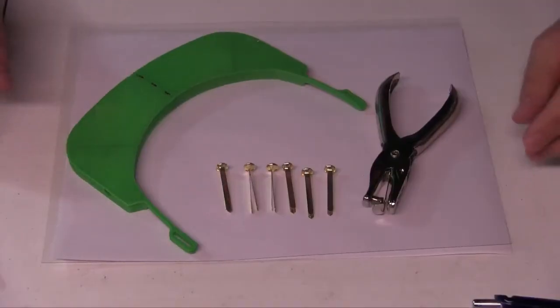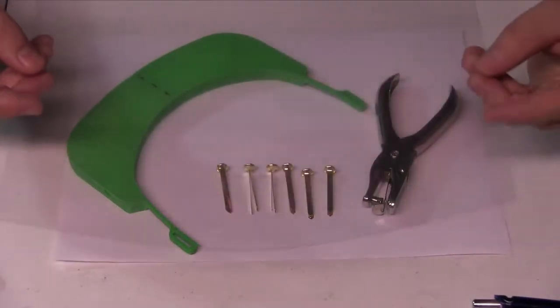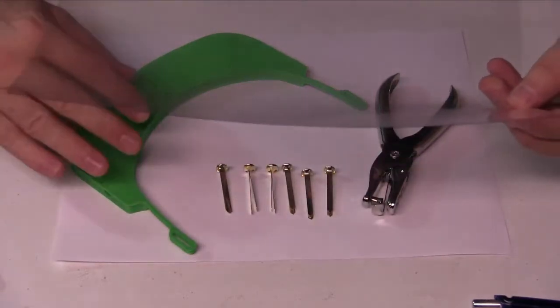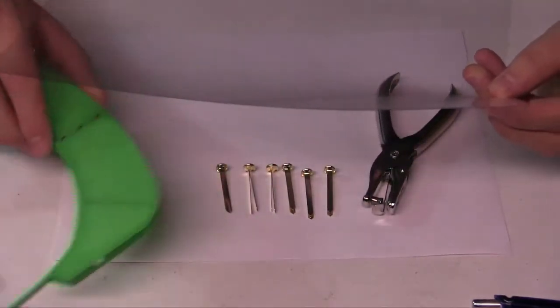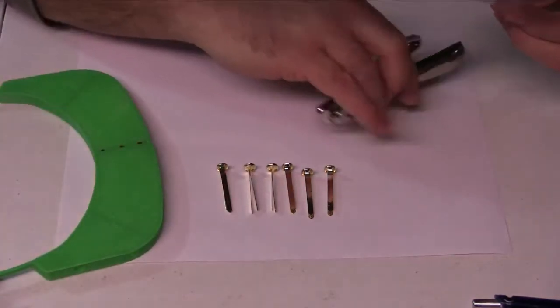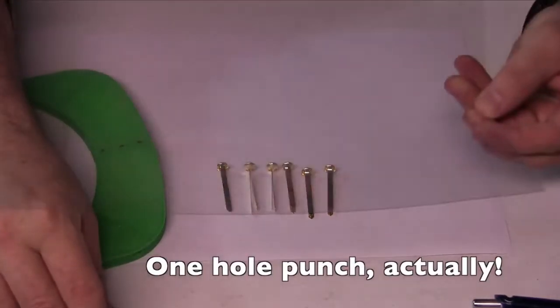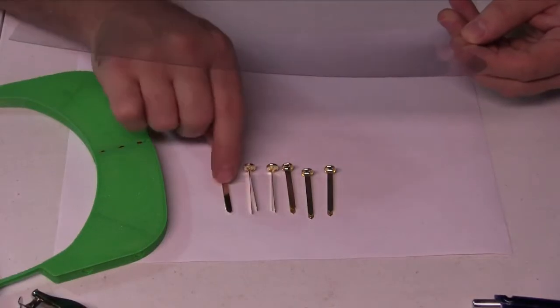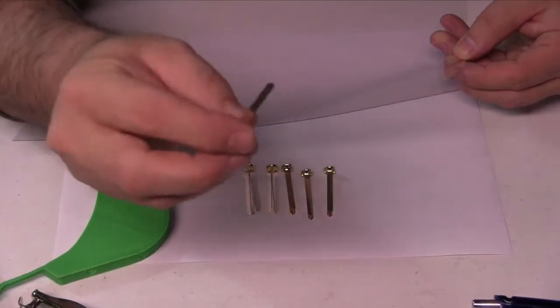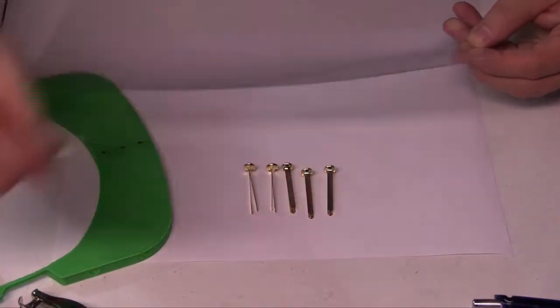Okay, for the next phase in this, we're going to be taking this plastic sheet here, which actually is the protective part of our device, and we're going to be attaching it to the front of this frame that we've created. I have a 3-hole punch to be able to punch holes inside of the plastic sheet. I have 6 metal brads. These are pretty long, so I would suggest getting shorter ones so that they're easier to install.